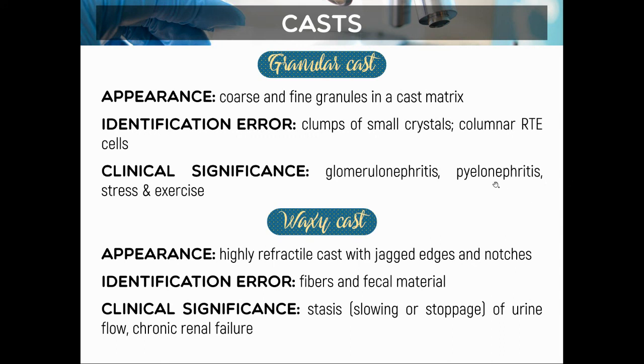And also in pyelonephritis, bacterial infection, and we have here also stress and exercise. And also we have our waxy cast. So waxy casts are highly refractile casts with jagged edges and notches.